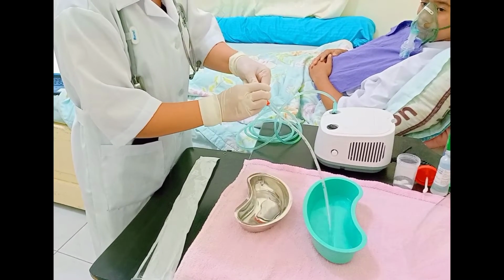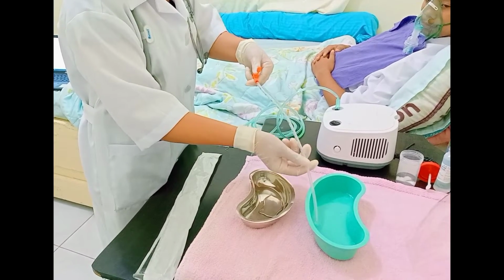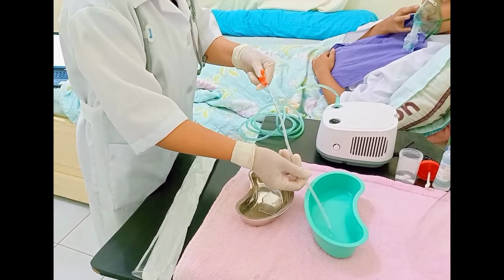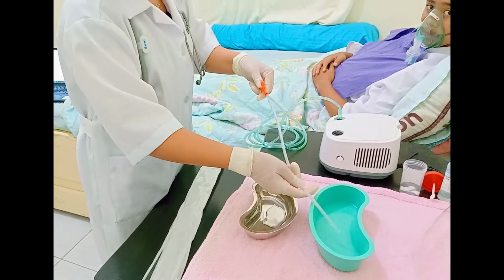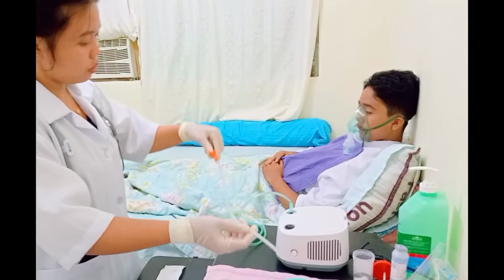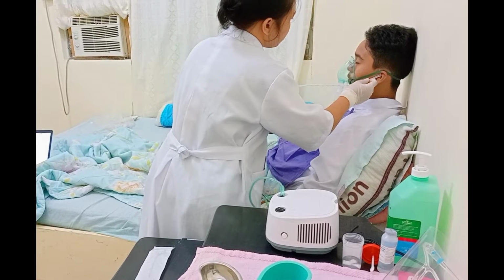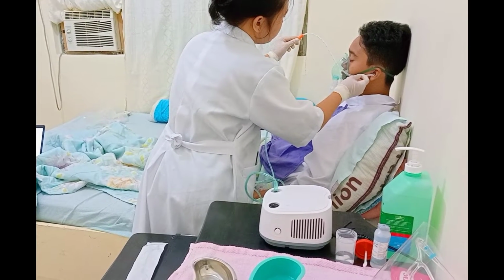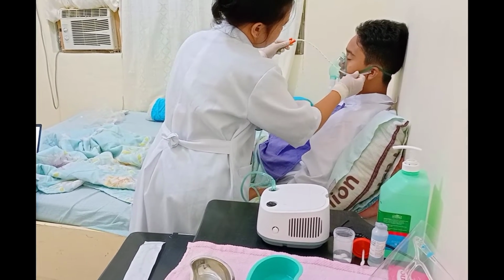Put the tip of the suction catheter into the sterile container of saline solution and suction a small amount of saline solution through the catheter. First, we need to measure the distance between the edge of the patient's mouth and the tip of the patient's earlobe. Also measure the distance between the tip of the patient's nose and the tip of the patient's earlobe.